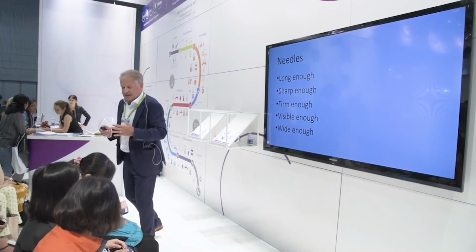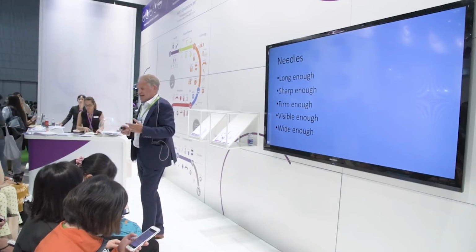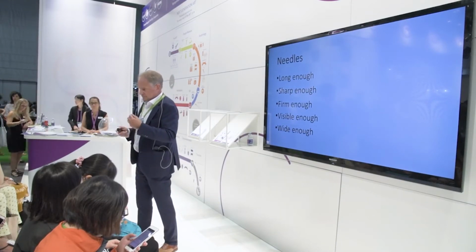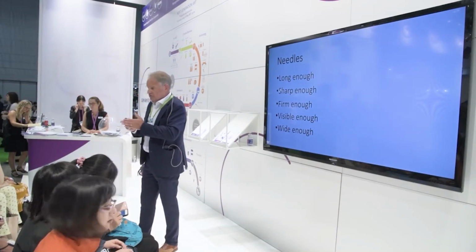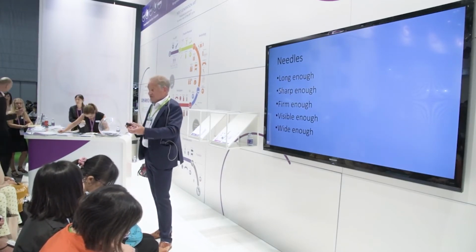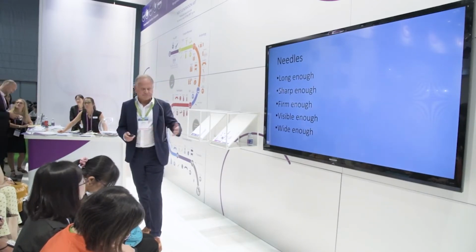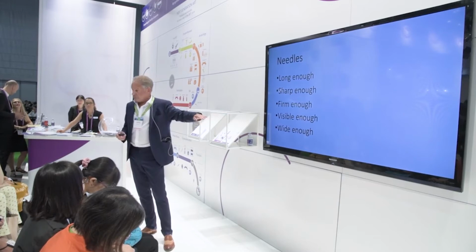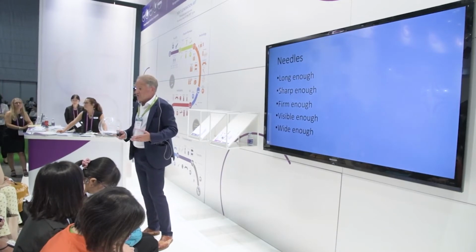And similarly, you need a pressure, extensively investigated by Carl Wood in the early 1980s, that doesn't exceed 150 millimeters of mercury. Because then, if your bore is too narrow or your negative pressure is too high, you're going to stand an increased risk of damaging the oocyte and giving it to the embryologist, who's not going to be very happy with you. So these are the things that I thought were very important. Fortunately, Wallace catheters made an 18-gauge needle, which I still use today.